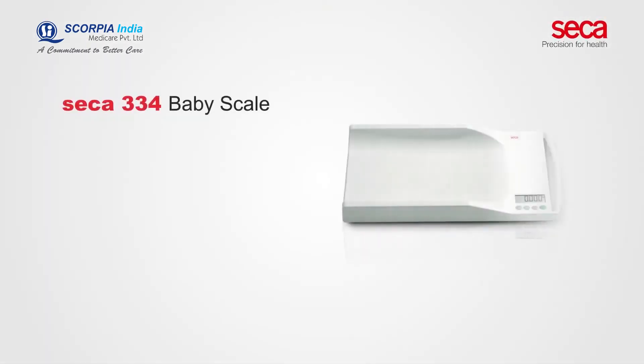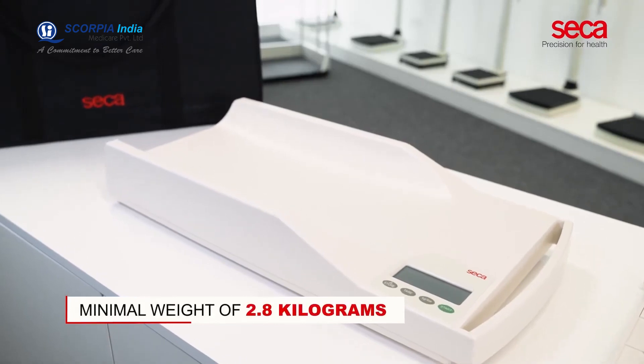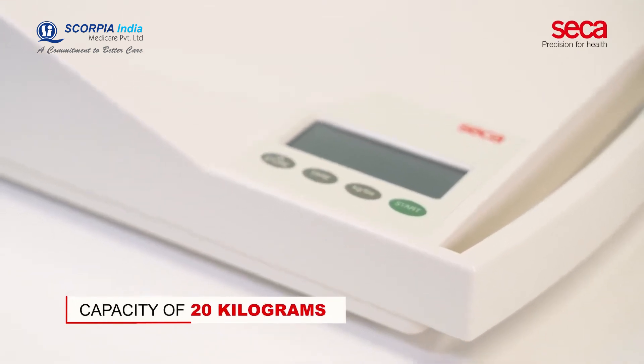The portability of Sika 334 comes from the flat and space-saving design, the integrated side handle, and the minimal weight of 2.8 kilograms. The Sika 334 has a capacity of 20 kilograms.